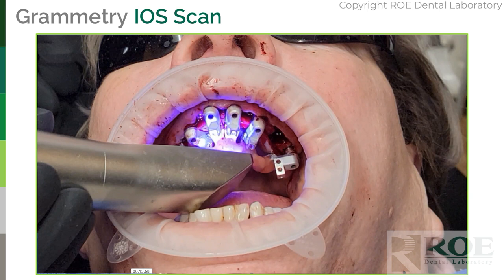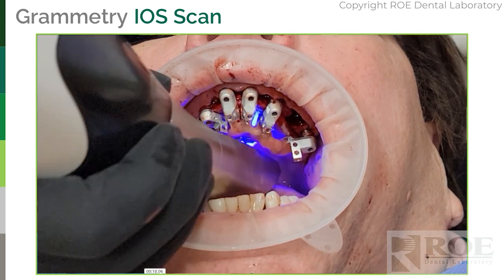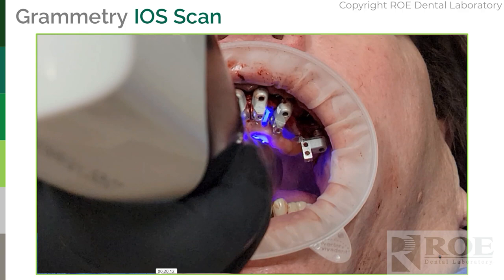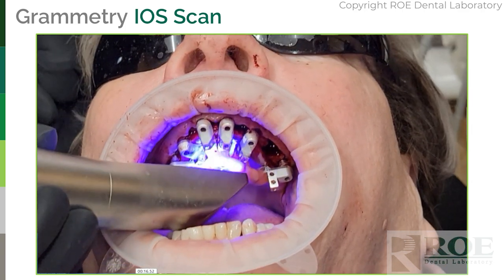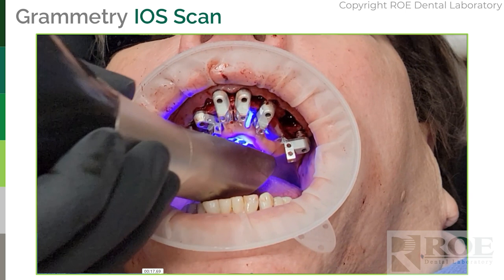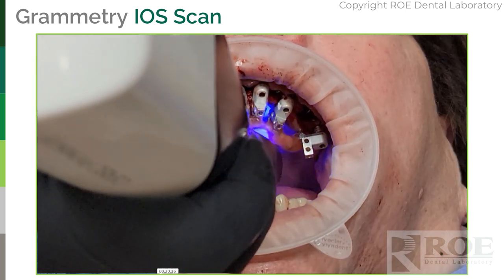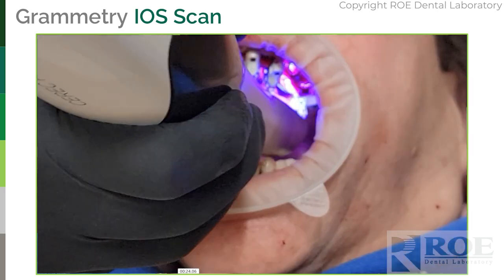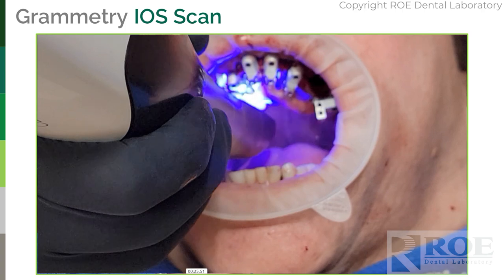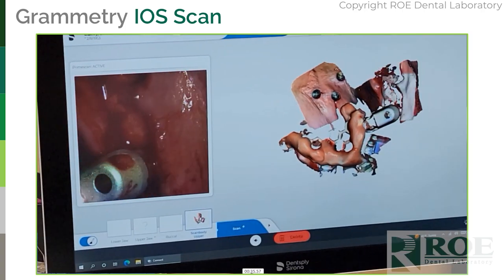in the middle and you scan the full area. You'll see this is pink. Okay, we have changed to white. They both work, but white's a little bit easier to scan. So you scan this area, scan the whole main plate, the main area of the OptiSplint. In this case, it's a really nice scanner, the Prime Scan, so the doctor actually grabbed the screws there as well. But once you scan the main area, then you start to come out.